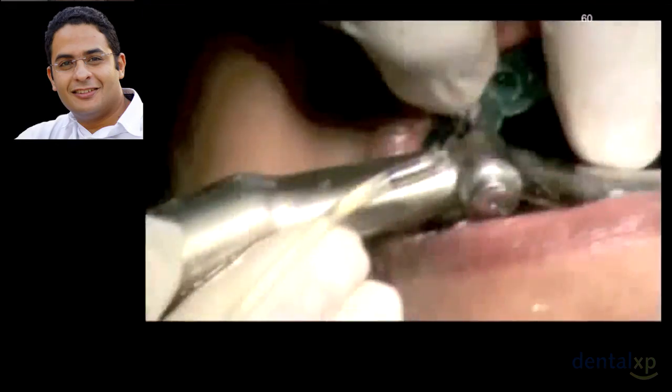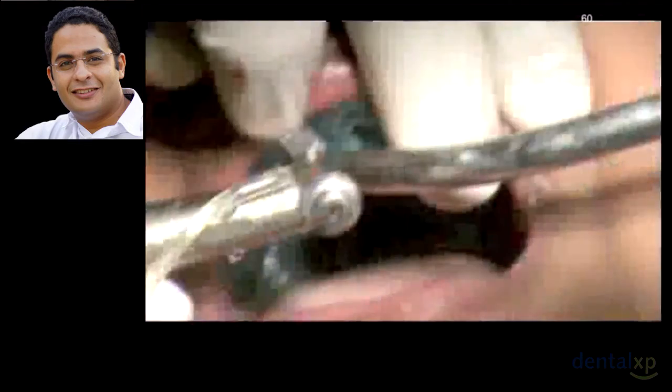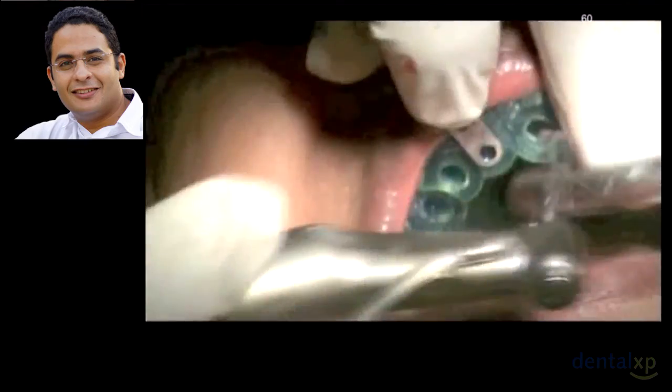Some guides use securing pins that are drilled inside the bone.